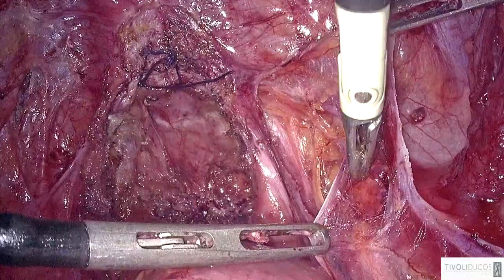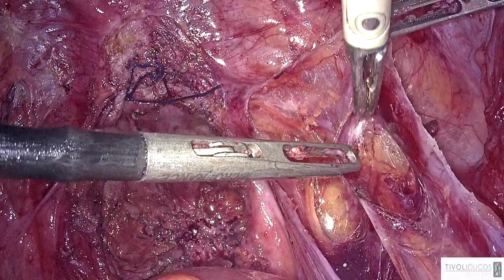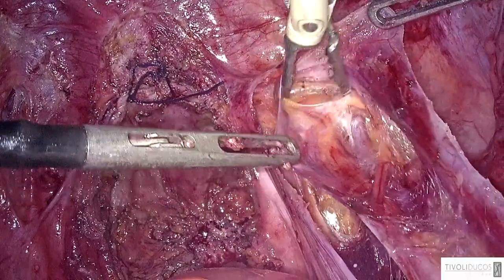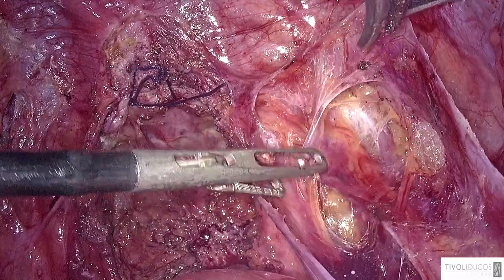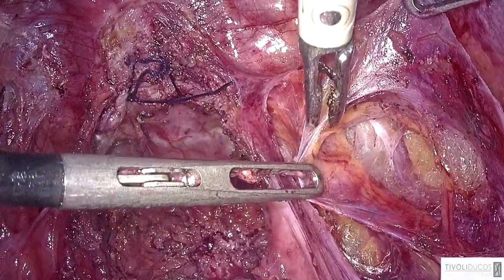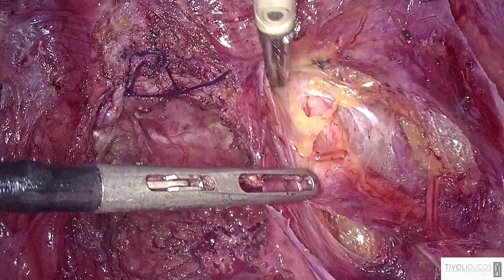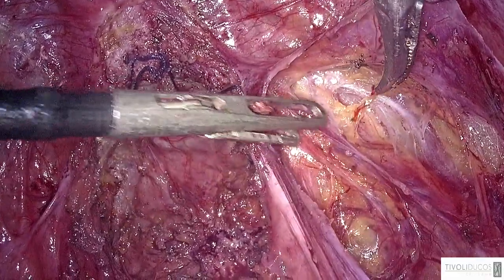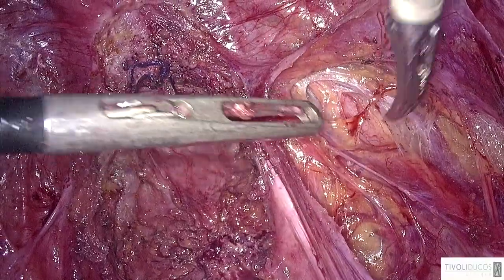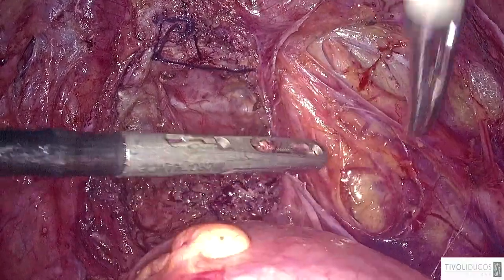Well, in endometriosis, there is a very, very different situation, because the splanchnic nerves may be involved by the disease when the nodules involve the parametrium. And in this case, you cannot section the nodule and save the nerves, because the nodule is very, very hard. And you can just take the decision to remove or not to remove the endometriosis. So I speak about the very, very large nodule of the parametrium, a nodule going down to sacral roots. Okay? But it is very useful to know where the nerves are located.